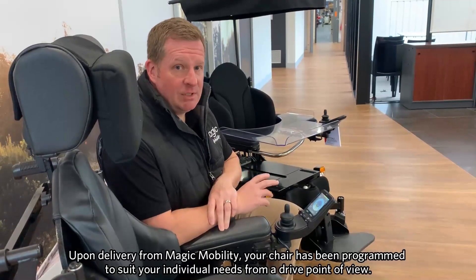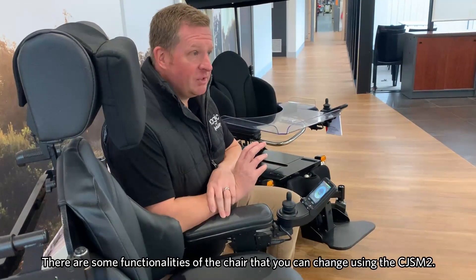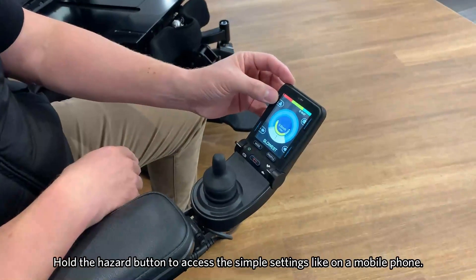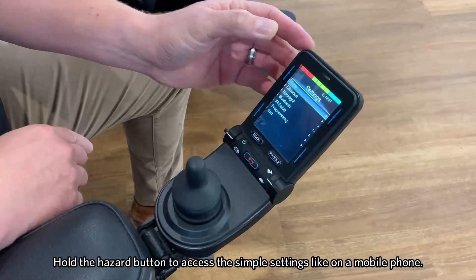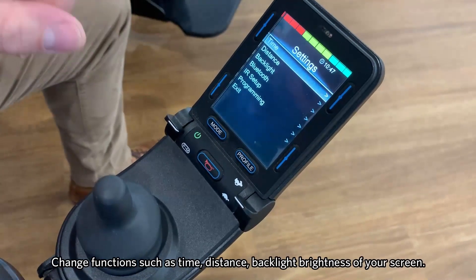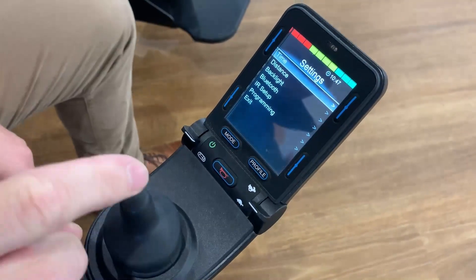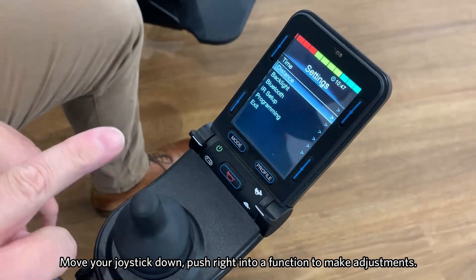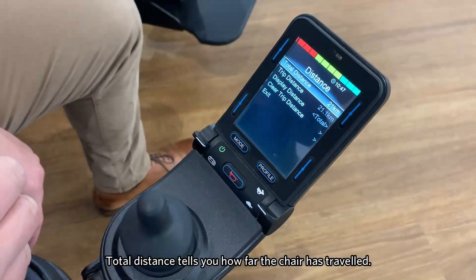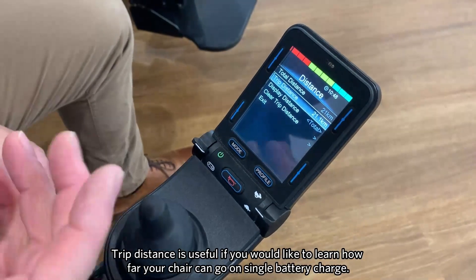With any chair that's delivered to you from Magic Mobility, the chair is programmed to suit your individual needs from a drive point of view. But there are some functionalities that you are able to change yourself, especially on the CJSM2. By holding the hazard button, this enables us to change some of the simple settings like you would on a mobile phone — functions such as time, distance, and how bright the screen is. To do that, we simply move the joystick down and then push right into that function to be able to change it. We can look at things like total distance, how far the chair's gone, and trip distance as well — so if you're trying to figure out how far the chair might go on one charge, this is a good function to use.